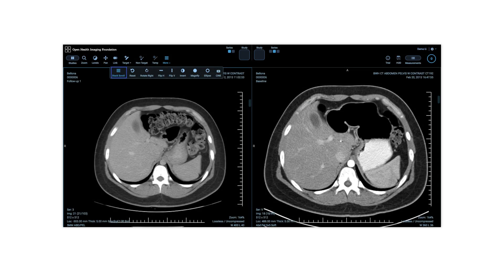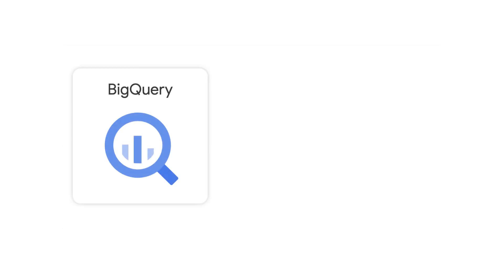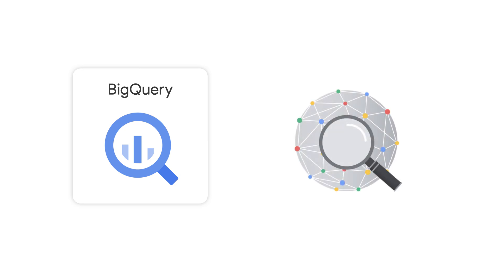Next, we can view the images from the DICOM store using OHIF, an open source medical imaging and viewing tool that integrates directly with the Google Cloud Healthcare API. Images can then be parsed into metadata and streamed to BigQuery for further analysis. BigQuery is Google Cloud's large-scale data warehouse that's great for storing, analyzing, and visualizing large datasets. With metadata ingested into BigQuery, it becomes much easier to search across a large amount of image metadata that wouldn't be readily searchable in other systems.